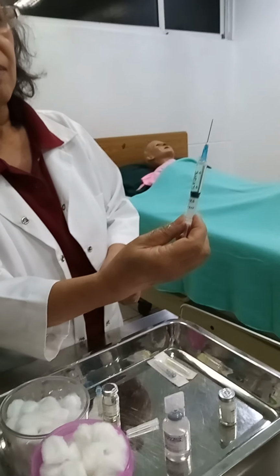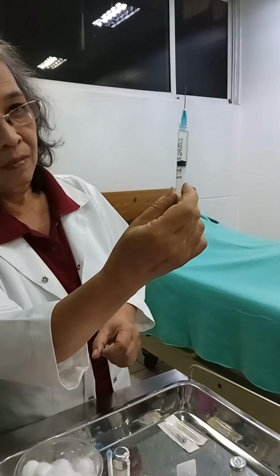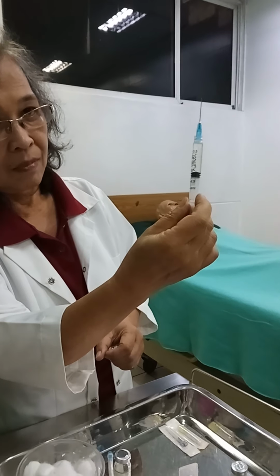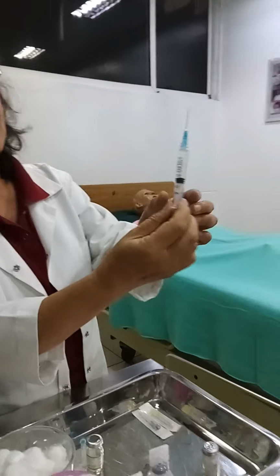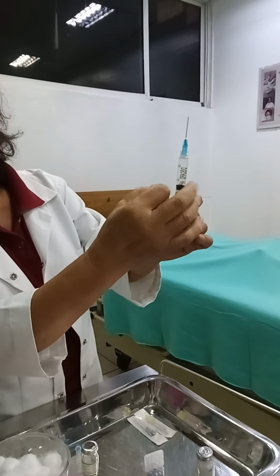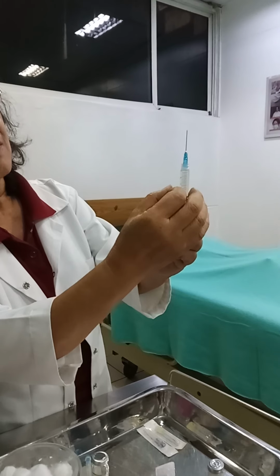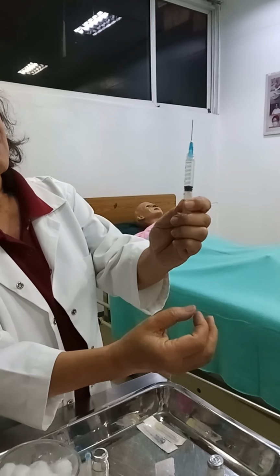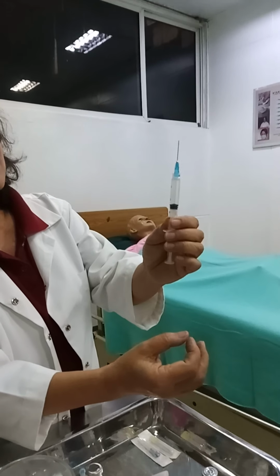Hold the syringe upright at eye level and ensure correct volume and absence of bubbles. Tap the barrel to dislodge any air bubbles. Pull back the plunger slightly, then push air out. Do not eject fluid.